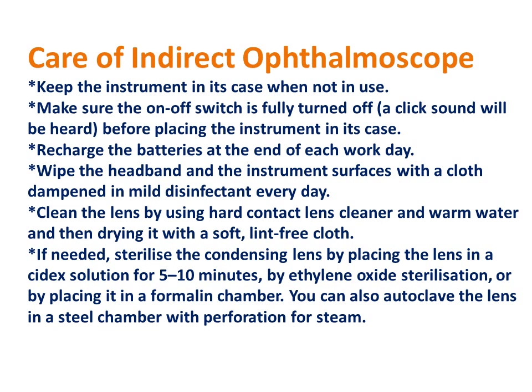Make sure that the on and off switch is fully turned off. A click sound will be heard before placing the instrument in its case. Recharge the batteries at the end of each working day. Wipe the headband and the instrument surfaces with a cloth dampened in mild disinfectant every day, because so many people would have used it. Even if one person uses it, we have to disinfect it by cleaning the surface with a cloth dampened in mild disinfectant.